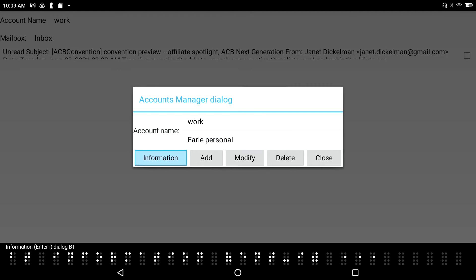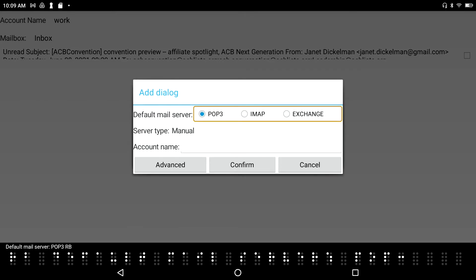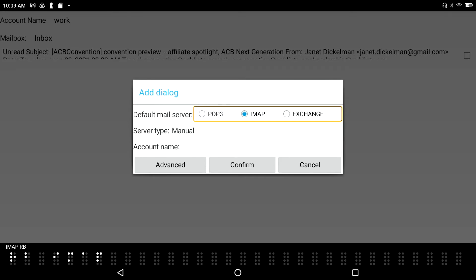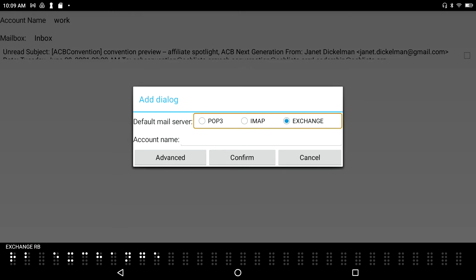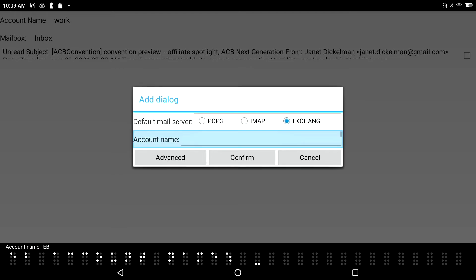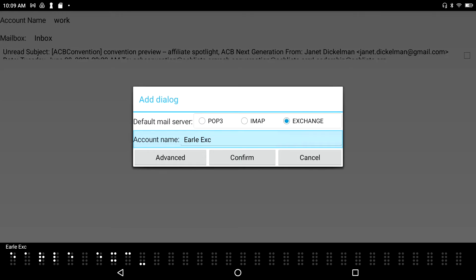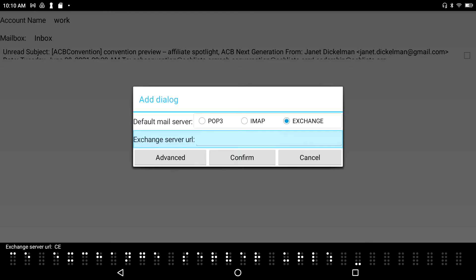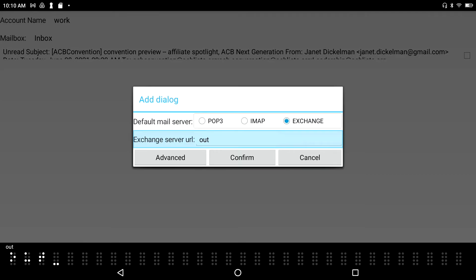Now I'll add another account — this time my Exchange account. Back in the Account Manager, I press Add. I select Exchange as the server type, name the account 'Earl Exchange', and type the Exchange server URL as outlook.com. I then enter my logon username: harrisonearle@outlook.com, followed by my password.